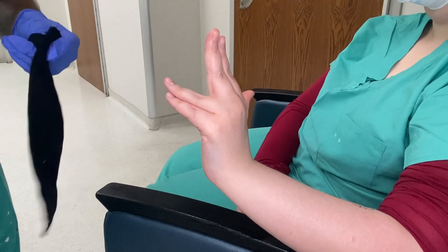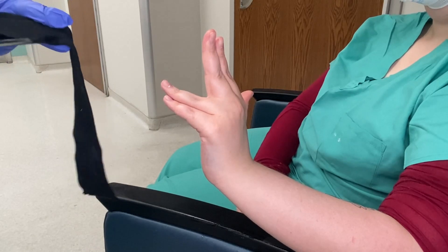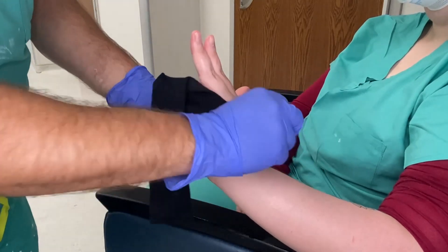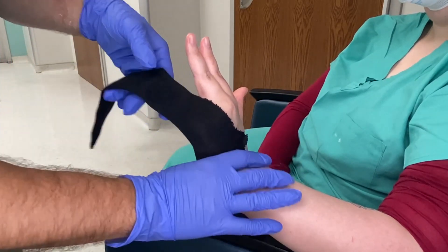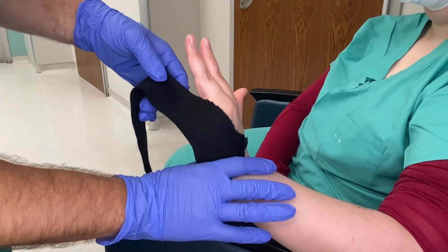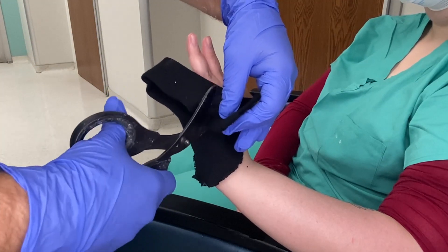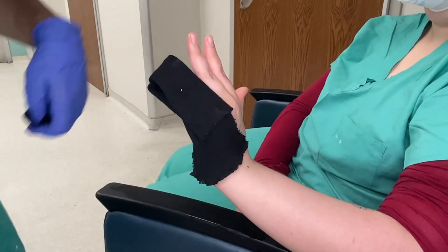Take some two-inch stockinette and place it over the fourth and fifth digit. You can also use one-inch if you want to, but if the patient has a lot of girth in their hand, the one-inch is just too small, so I would usually use the two-inch. Tuck it in so it stays out of the way, then cut the excess off right at the MCP joints and set it aside.